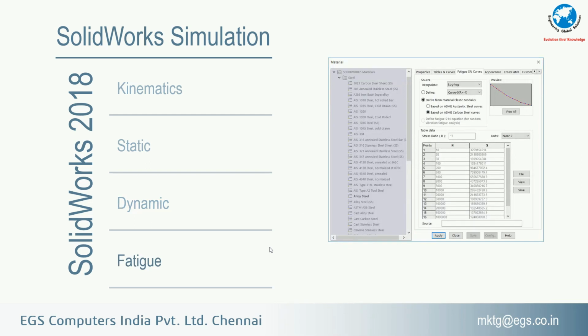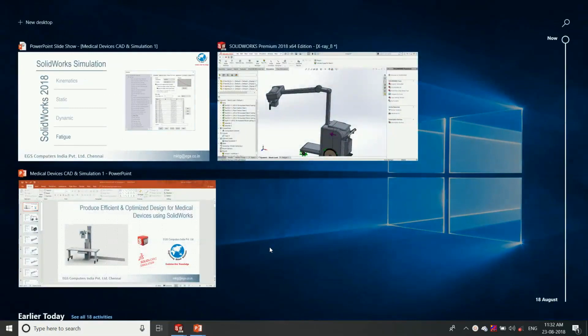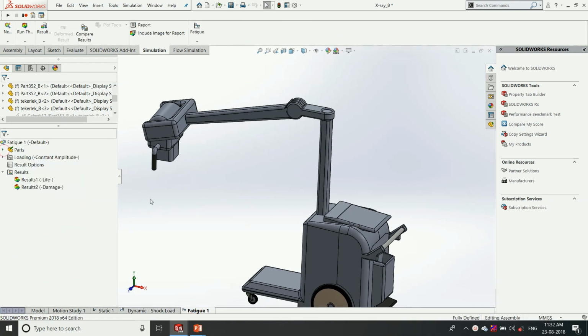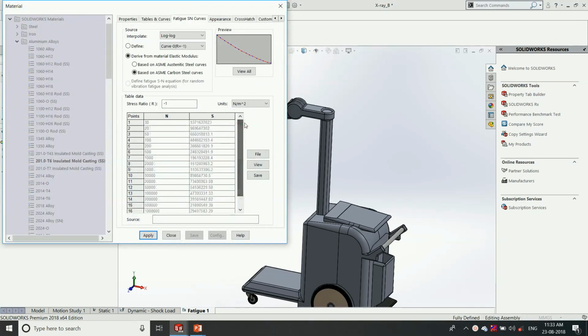Now in fatigue analysis, we are going to study how long the structure will withstand, or how long the X-ray machine can perform without any kind of damage or malfunction. In the fatigue study, we define the load conditions for repeated cycles. For example, we define the number of loading cycles, and we will calculate how long it will last, for a 6 month lifespan or 1 month lifespan. Through this, we can predict the warranty and guarantee of the product, so that we can eliminate sudden failure of the component. In this option we choose the material database, and for the fatigue study we need the SN curve, which is already a built-in function in SOLIDWORKS Simulation.